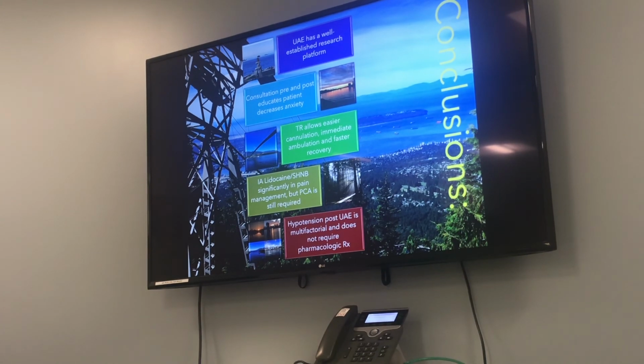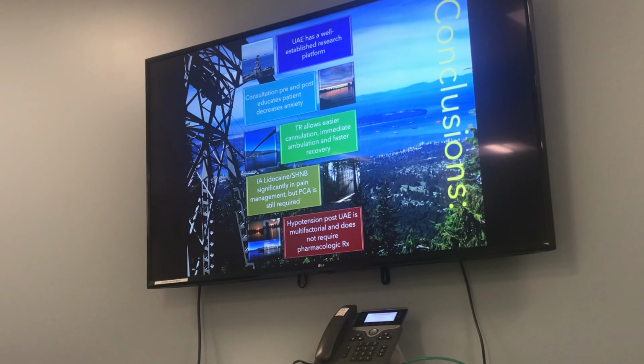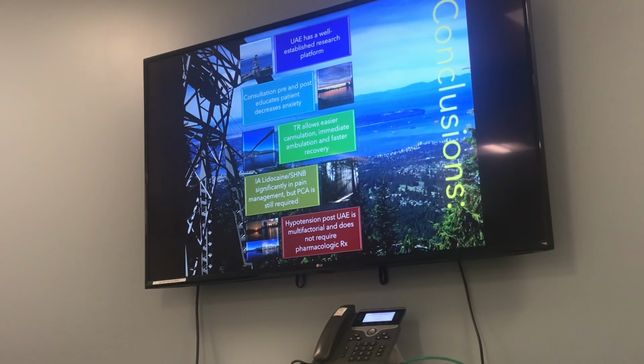Twice or three times when they come up to you. If they're already like an hour post-procedure, doing a neurological examination is almost pointless, because the hemostasis is done. There's nothing really that you're going to gain by doing that. So almost always, and I'm not sure what my colleagues do, the neurological assessment that we recommend will have been done in peri-procedural care. So you shouldn't really have to do that.